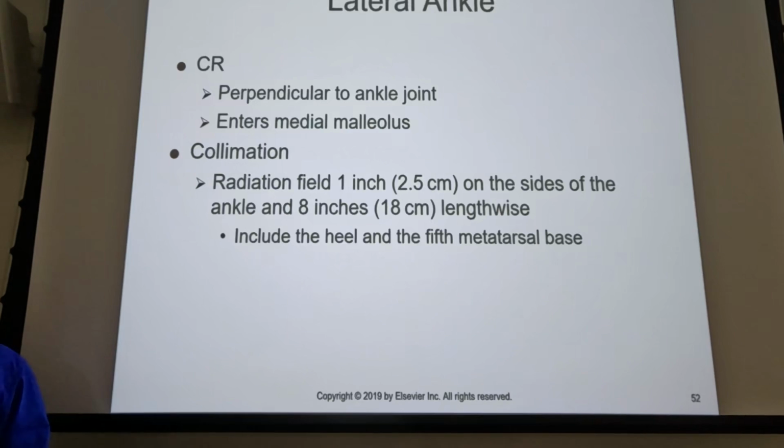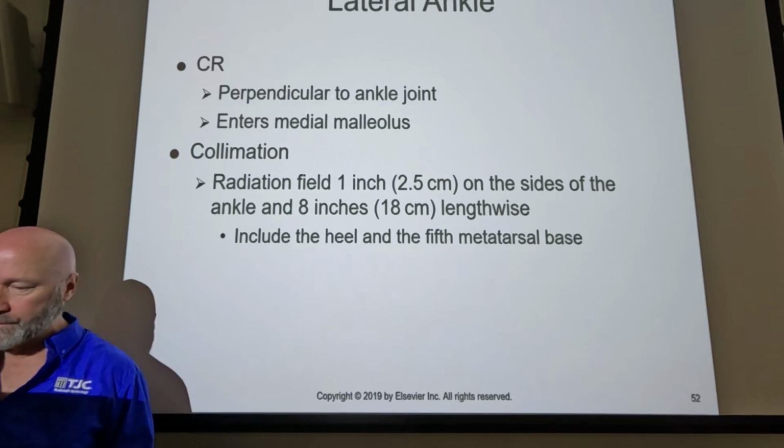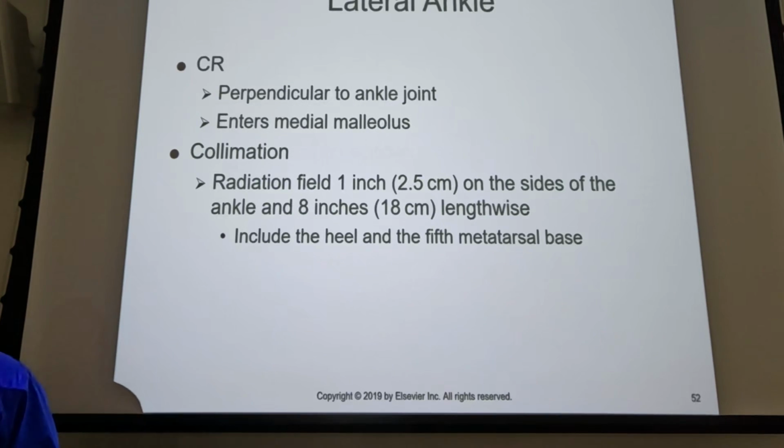So again, I saw this 3 times, 2 in the ER, and 1 was a patient up in the room, a young woman, and she was getting ready to go to surgery to repair this. And the tech went up to take the x-ray. She was in a splint. And what is the rule for splinting? Don't take it off. Don't take it off. Don't take it off. And guess what they did? They took it off.